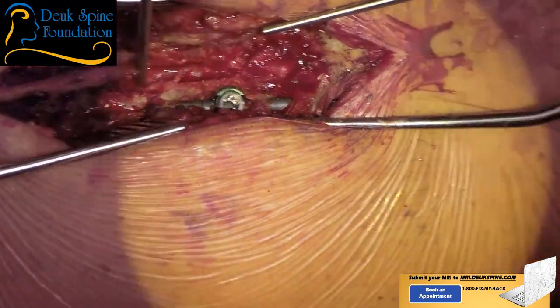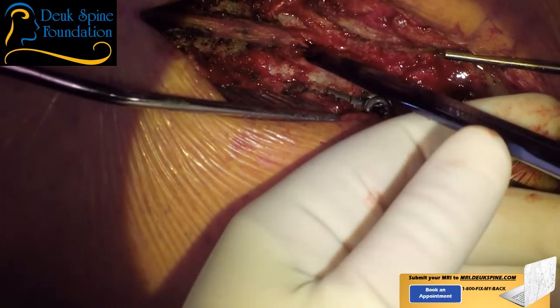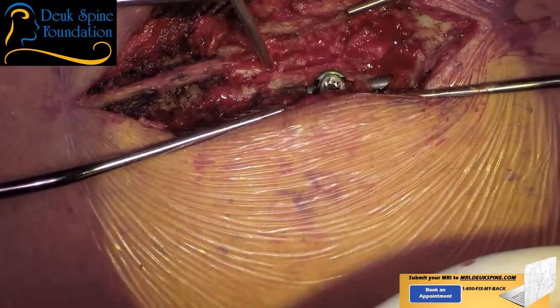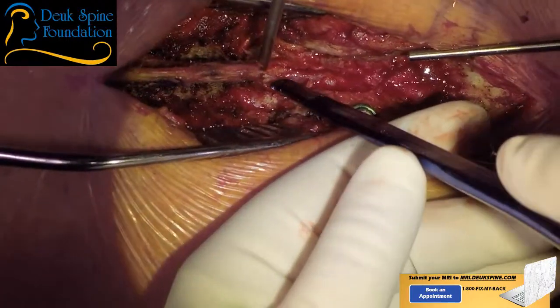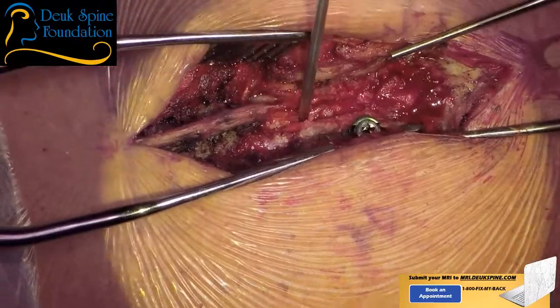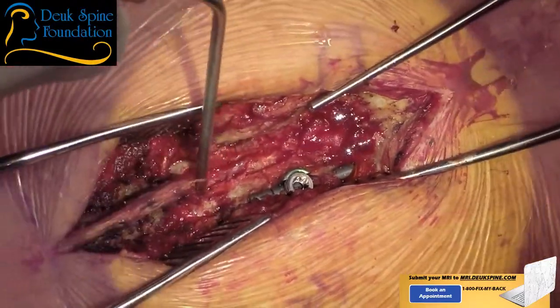And you gotta run to the bathroom or you won't make it. And then, of course, if you don't get the fix, it's gonna get worse. Pretty soon, you'll just be peeing on your own self, peeing in your pants. You won't even know it. Your bladder just releases. All right, we're done with the laminectomy up here, but I gotta go further south.